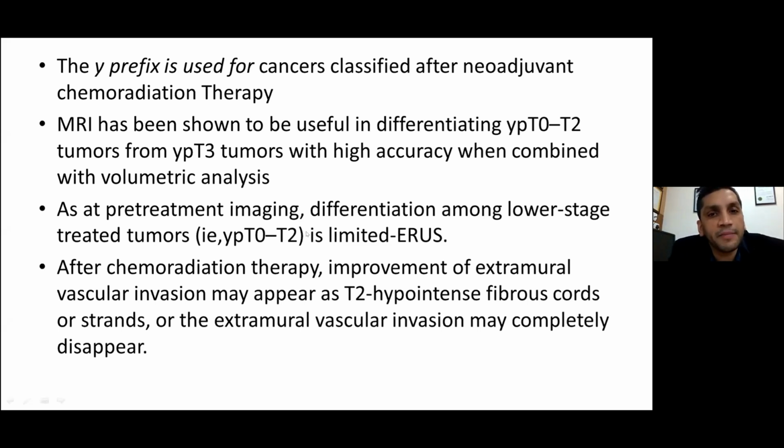As at pre-treatment staging, differentiation among lower stages is again limited. And after CTRT, improvement of extramural vascular invasion. So whenever in the previous cases you would have seen how the vein was dilated, these tumors can completely regress, and EMVI can completely disappear post-treatment.